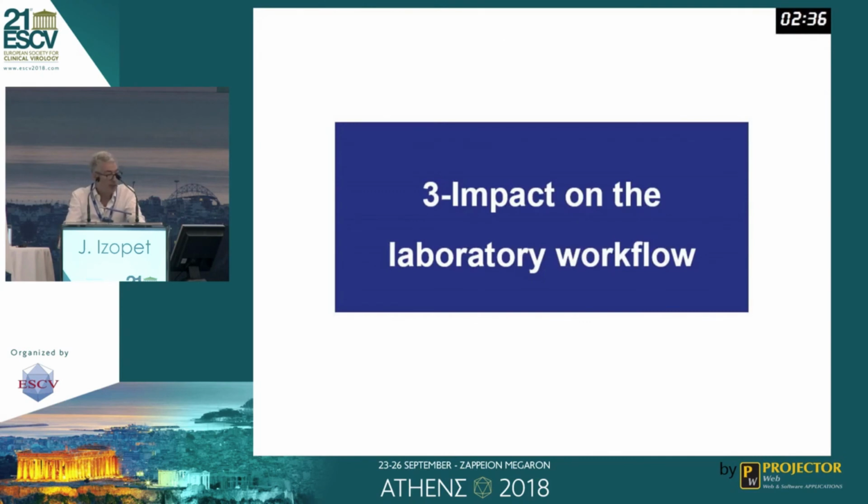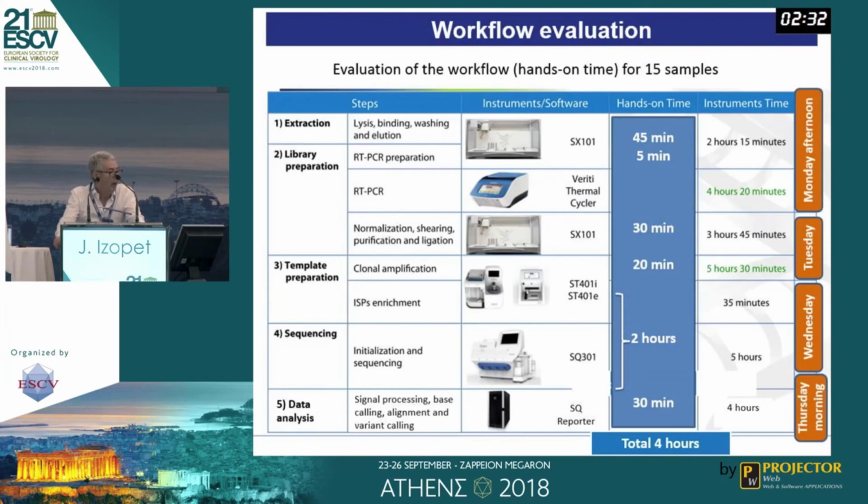Regarding the impact on the laboratory workflow, to finish, the hands-on time for 15 samples is shown here. 45 minutes for extraction, 35 minutes for library preparation, 20 minutes for template preparation, 2 hours for sequencing, and 30 minutes for data analysis. In total, 4 hours.